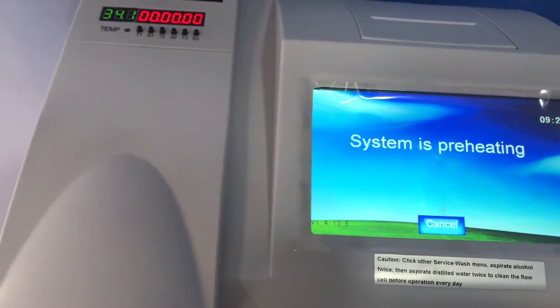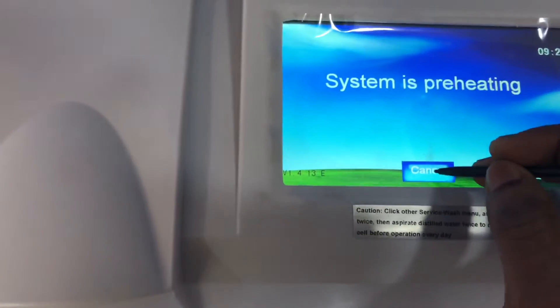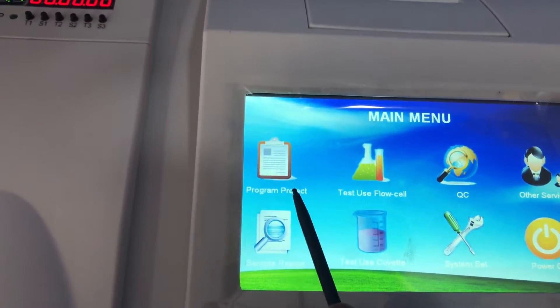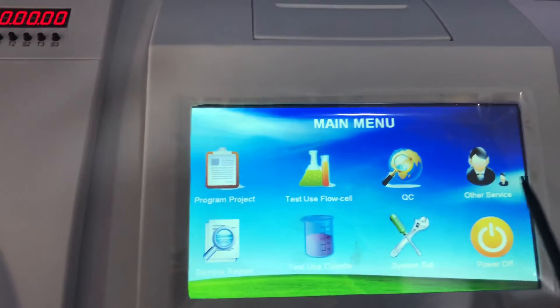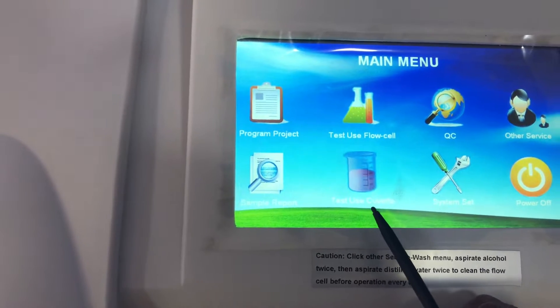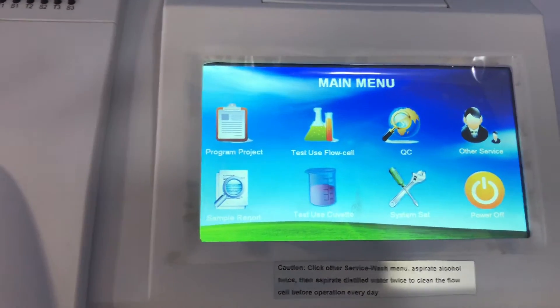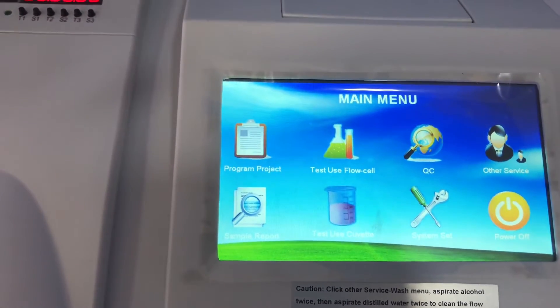I'll click cancel to get into the main menu. In the main menu we have: Project, Test Use Flow Cell, QC, Other Services, Sample Report, Test Use Cuvette, System Set, and the power button. I'll take you through all of these as we go through this series, but in this first video I want to take you through the maintenance procedure.